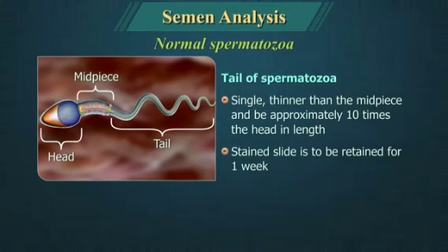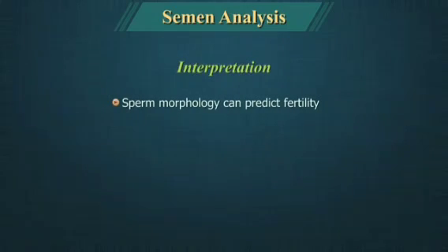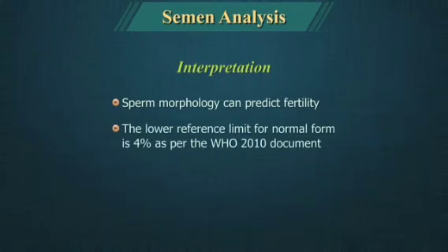The stained slide should be retained for 1 week. Sperm morphology can predict fertility. The lower reference limit for normal forms is 4% as per the WHO 2010 document.